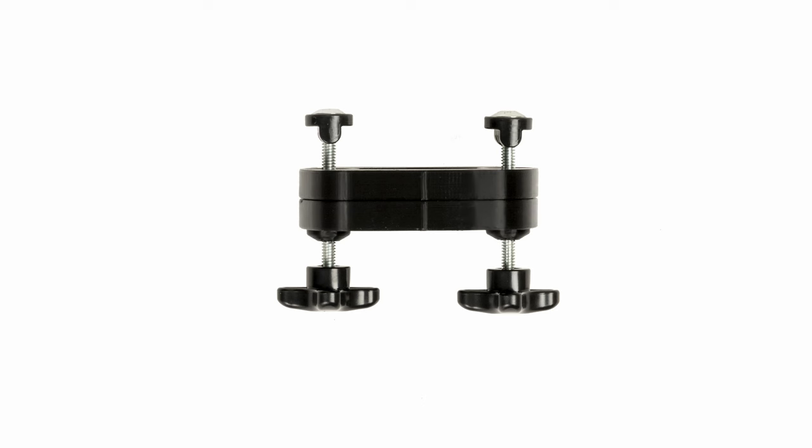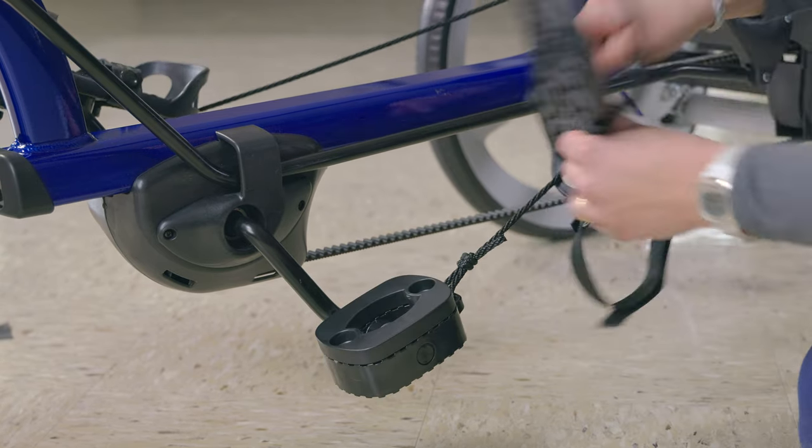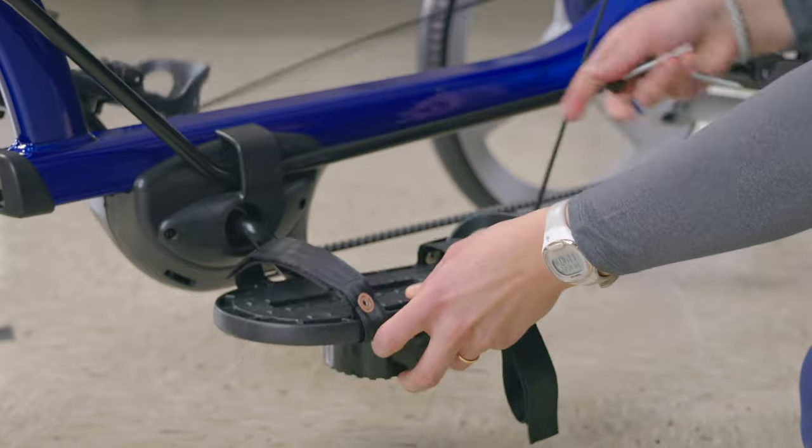Moving down to the feet, there's a pedal raise kit consisting of two half-inch blocks. This allows you to accommodate for a leg length discrepancy. The block — either one or both — can be placed between the sandal and the pedal underneath the foot of the shorter leg.